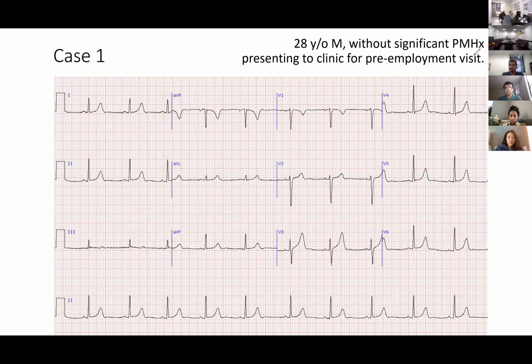Can you hear me? No, it seems that Rafa had... Juan? Can you do it again, Juan? Sorry. Can you hear me? Yeah, we can hear you now. Yeah. So standardization seems normal.